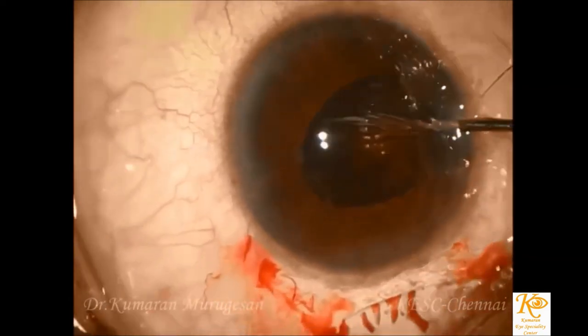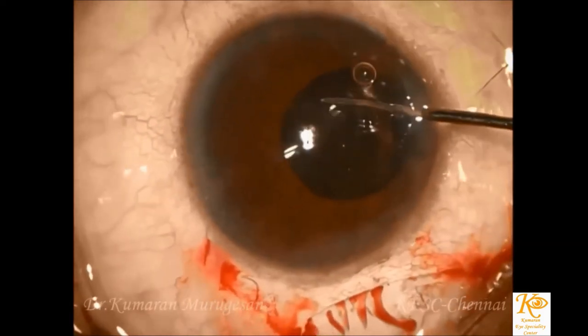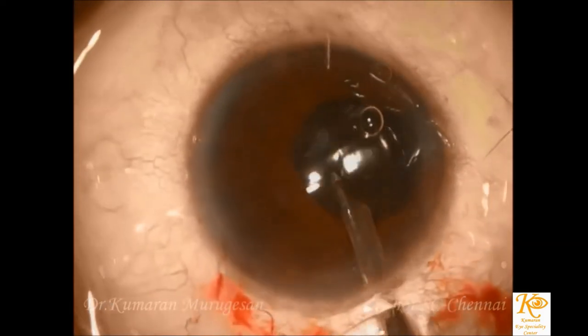The anterior chamber is then filled with balanced salt solution, the side port irrigated after intracameral moxifloxacin, and the conjunctiva is sealed.